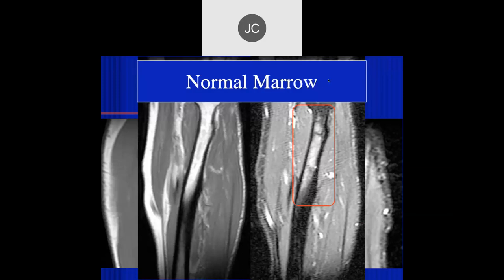This is actually normal bone marrow. The proximal radius is one area in the extremities where even as you get older you continue to have hematopoietic marrow, so it's very common to have something that looks like edema here. This bothered me for a long time when doing elbows and looking for injuries at the distal insertion of the long head of the biceps tendon - for a while I would call these traction injuries, but this is just normal.